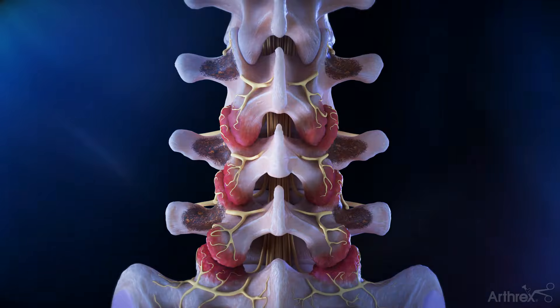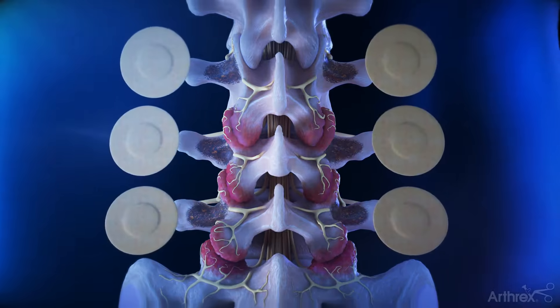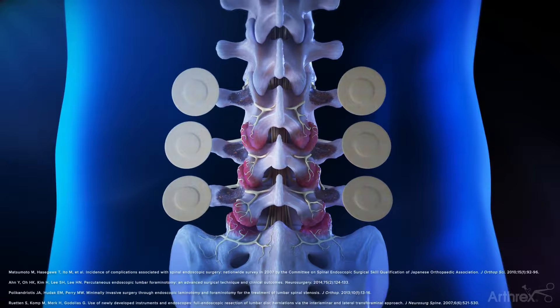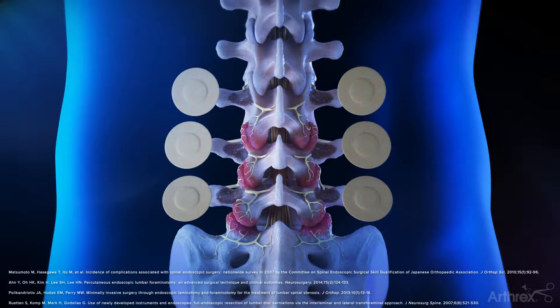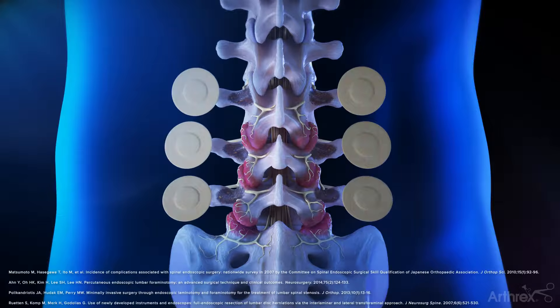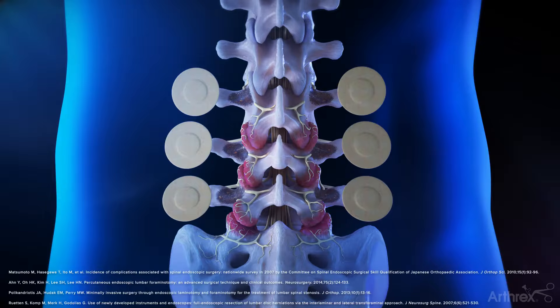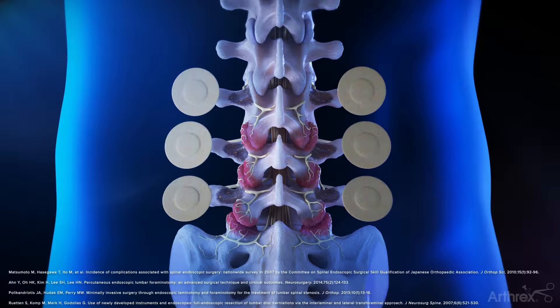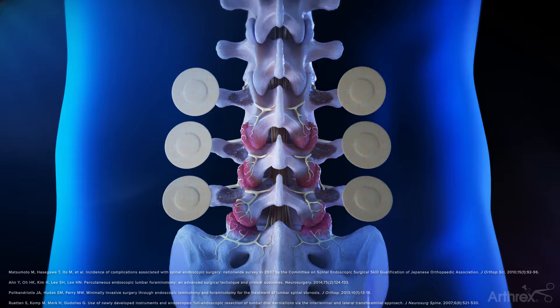At the conclusion of your surgery, a stitch or two might be used and a small bandage placed over each incision. Research has shown that endoscopic approaches to spine surgery achieve fewer post-operative complications and a reduced risk of infection, which can lead to a faster recovery, including a quicker return to normal activity.